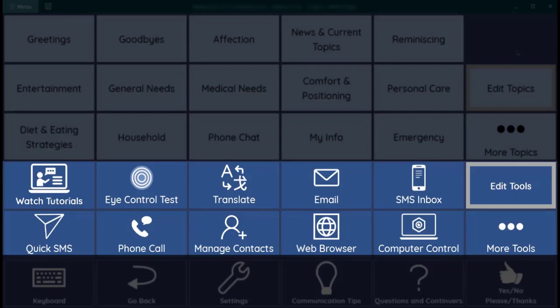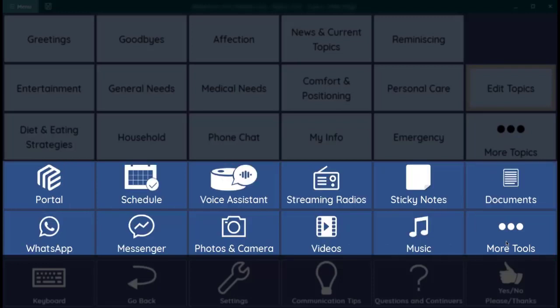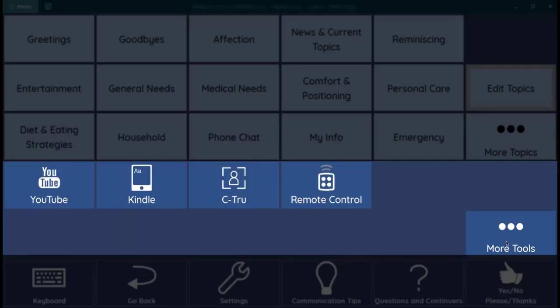In the middle of the page are medium blue Tools buttons. There are a wide variety of tools available that enable people using an alternative access method such as eye tracking to independently listen to music, send a text, read a book, navigate the web, and more. You can see all your tools by selecting more tools.